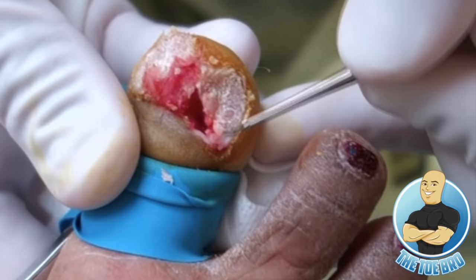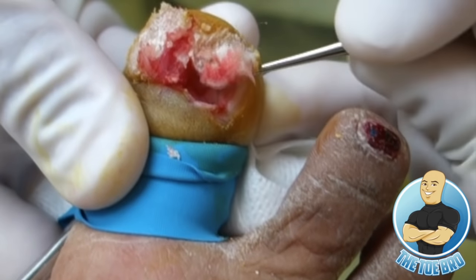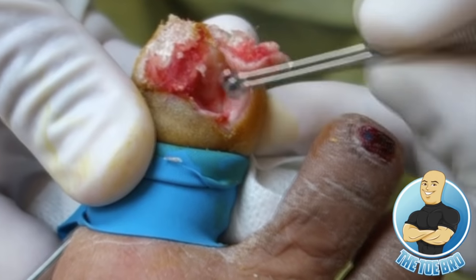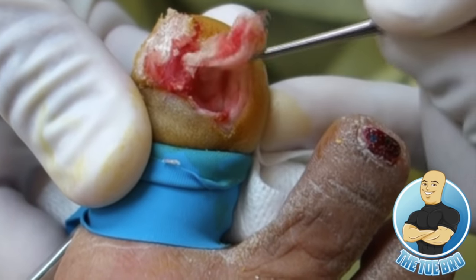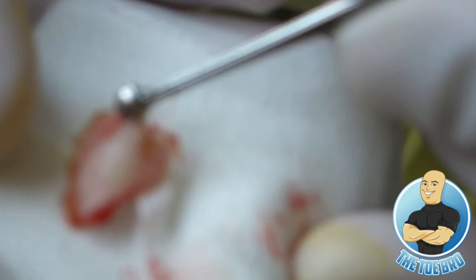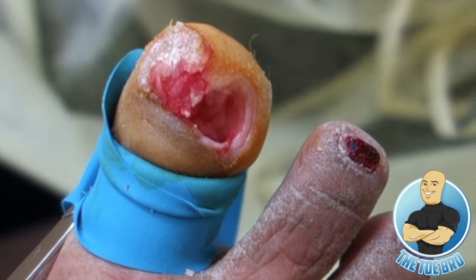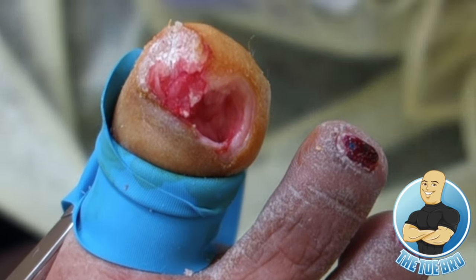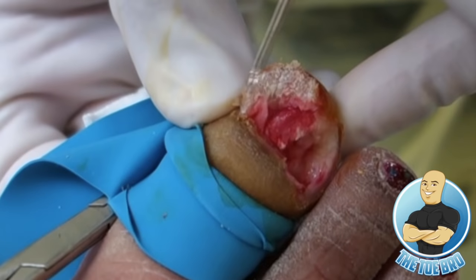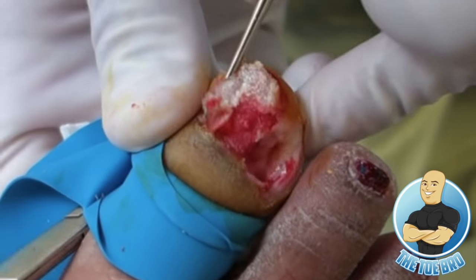No pain? No. That's good. Almost done? Almost done. One down, one side done. And we do the next side. So that one you already scraped the skin? And the wart, one side, yeah.